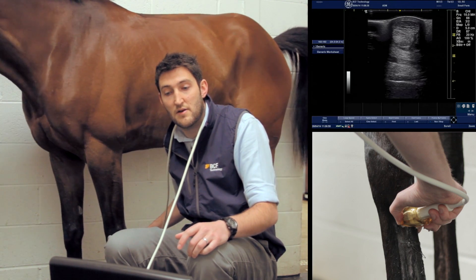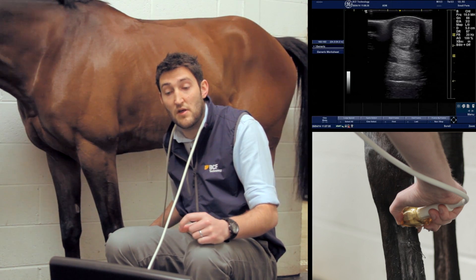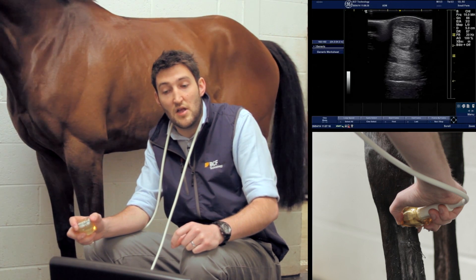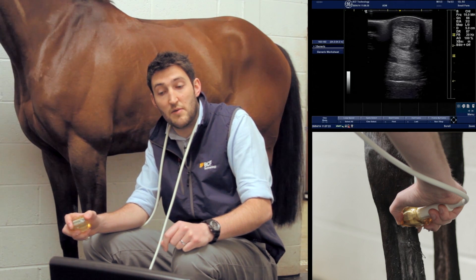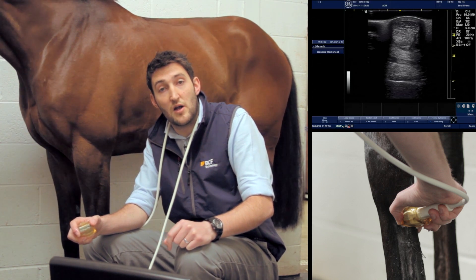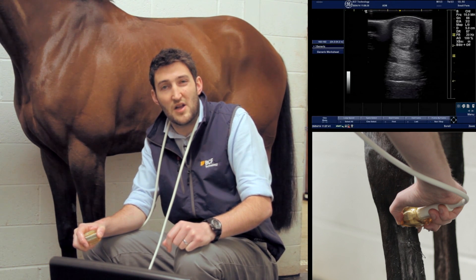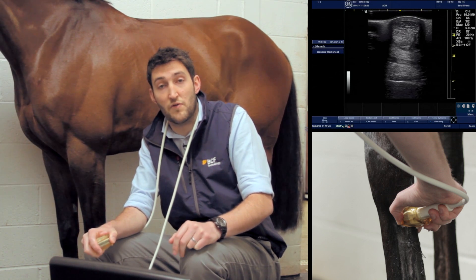The superficial digital flexor tendon still has that slightly hypoechoic appearance relative to the deep digital flexor tendon. At this stage the superficial digital flexor tendon is starting to flatten out and become wider — thinner in the dorsal-to-palmar direction but wider laterally to medially. The deep digital flexor tendon appears much as before, with a little fluid still in the carpal sheath. The check ligament fibers again look slightly different due to their oblique orientation, and below that the suspensory ligament body is visible, with the thin white line of the palmar surface of the cannon bone at the bottom.